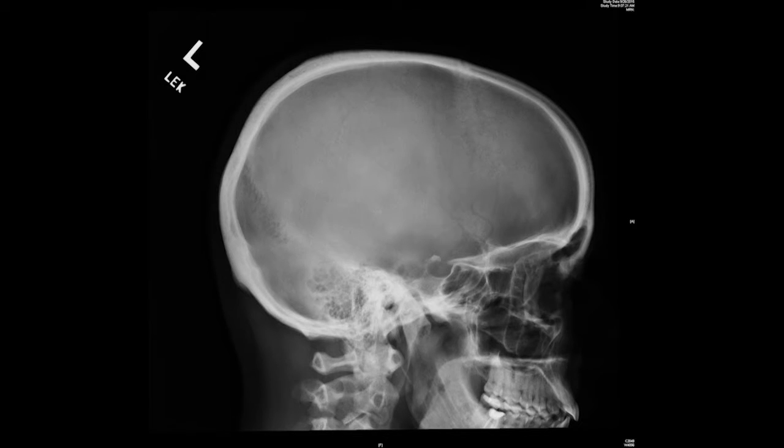For a properly positioned lateral image, the sella turcica and clivus are demonstrated in profile. The EAM and orbital roofs are superimposed, showing no tilt or rotation. The IOML is parallel to the IR. This is visualized by the base of the skull being separated from the C-spine.